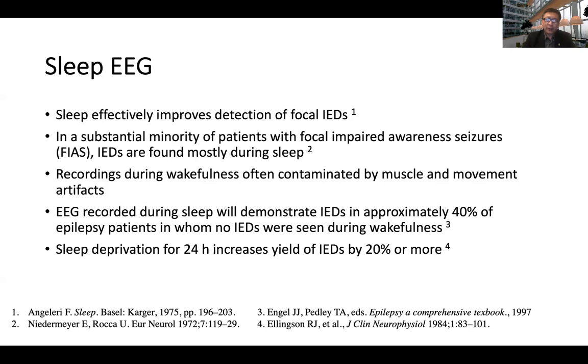The EEG recording during sleep demonstrates IED in approximately 40% of epileptic patients in whom no IED was seen during wakefulness. Sleep deprivation for 24 hours increases the yield of IED by 20% or more.